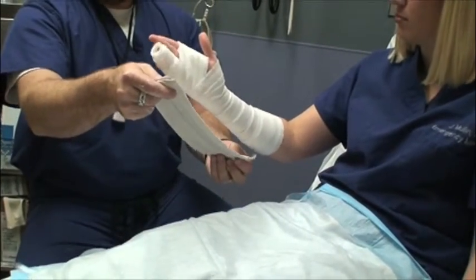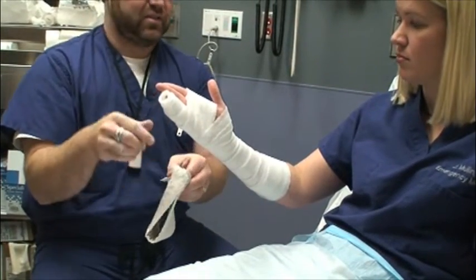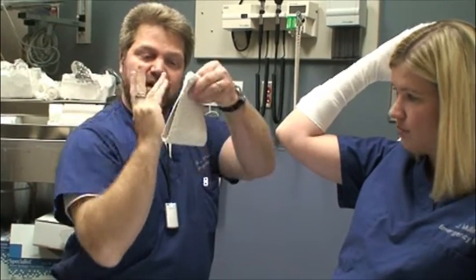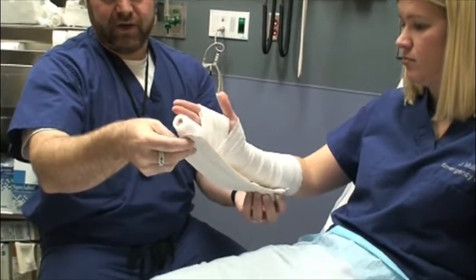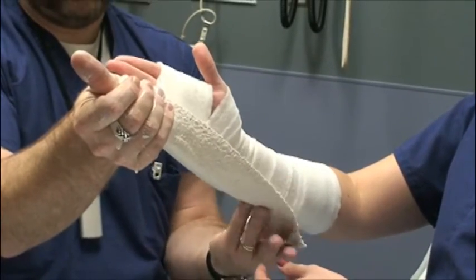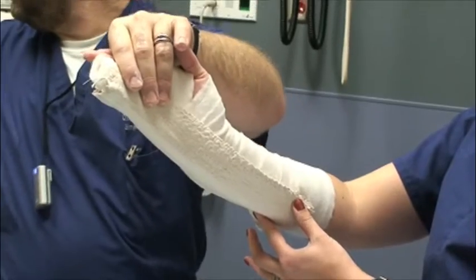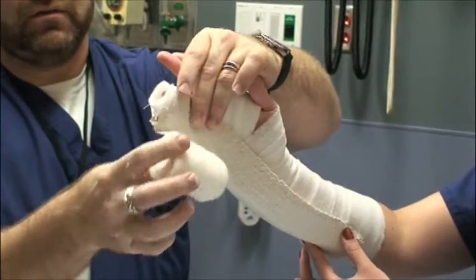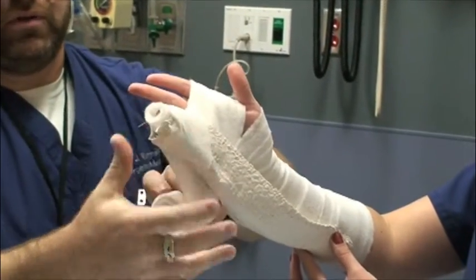If you're working by yourself and trying to put this on, one thing you can do is lay your patient flat and have them bend their arm so that when you apply the plaster it'll stay on by gravity. Or you can have your patient act as an assistant, or grab a tech to help. Just hold that one end for me.